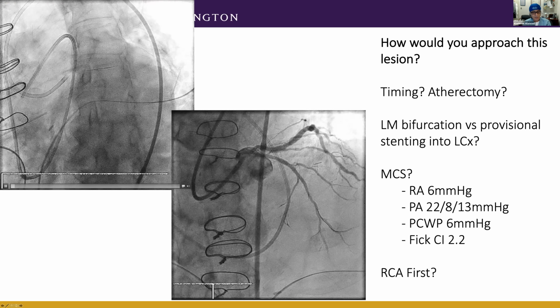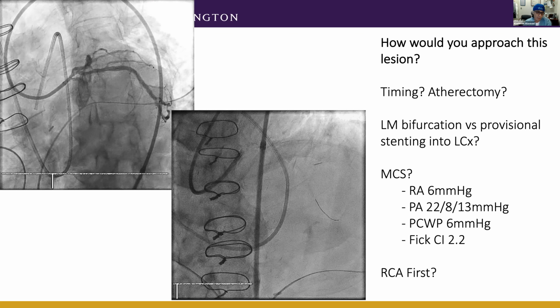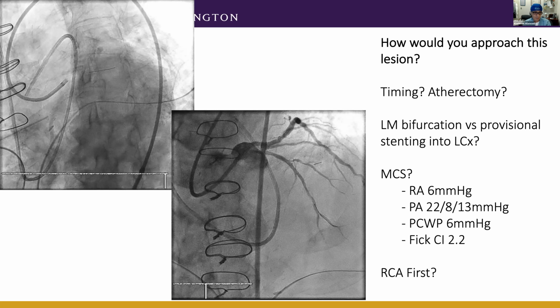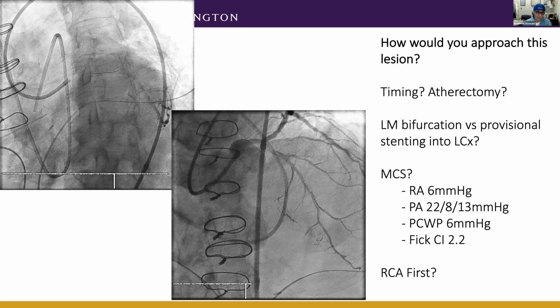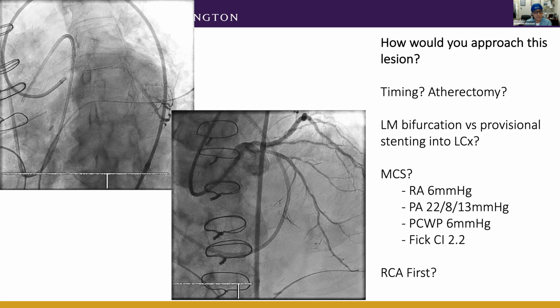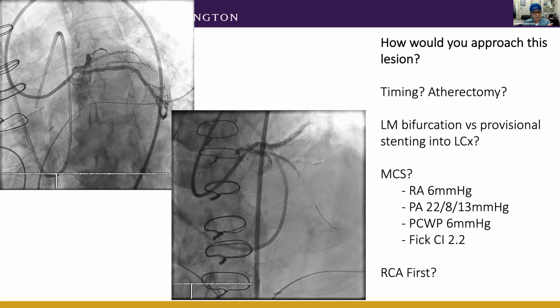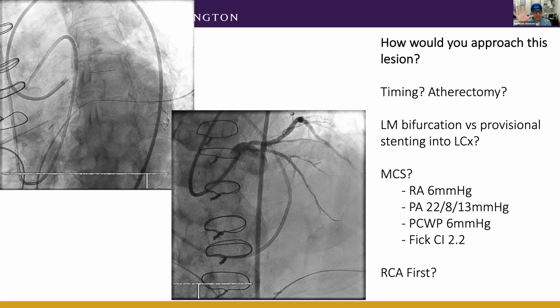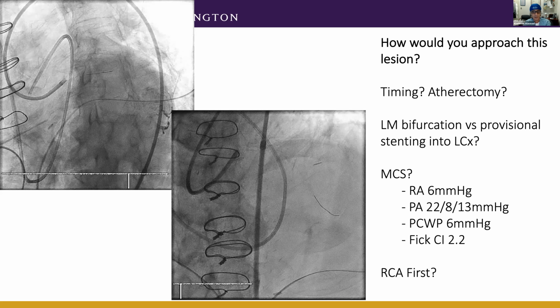And if you're worried about bleeding with 8 French versus 6 French, that means you're not practicing best practice for accessing the groin. You have to use ultrasound and fluoroscopy. Then after that, you talk about the strategy for the bifurcation stenting. There are zillions of strategies you can approach this with, and regardless of what you do, you're never going to figure out what to do without intravascular imaging.